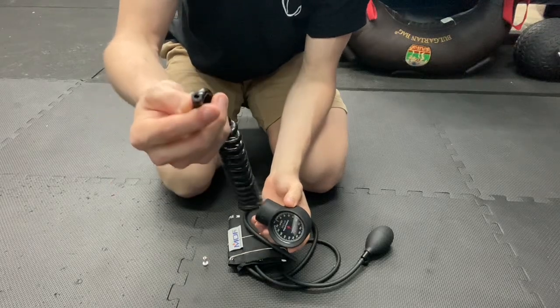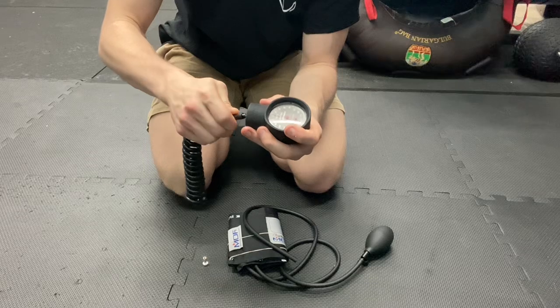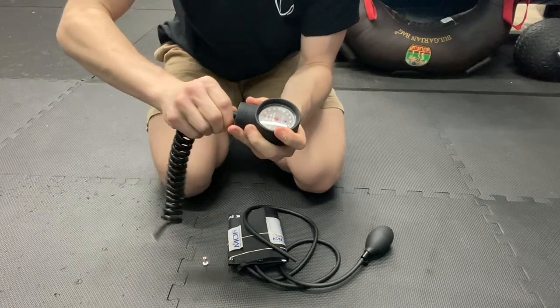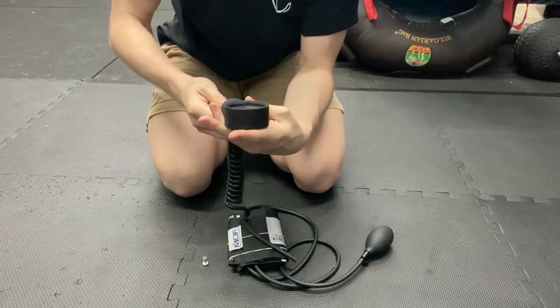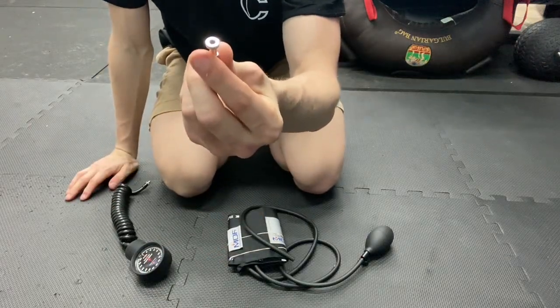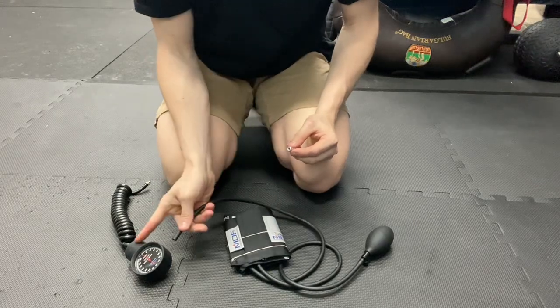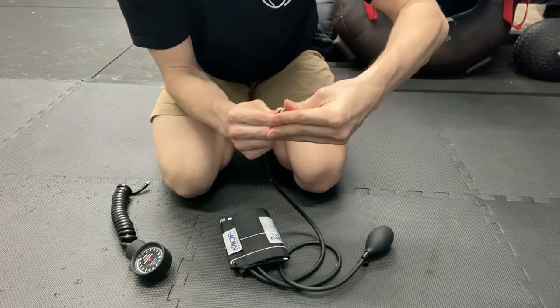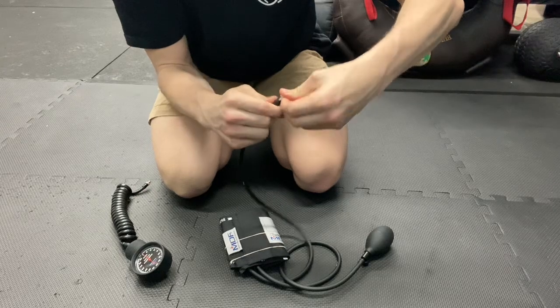So now you're going to take your hose, the empty hose part, and you're simply going to replace your initial hose with this hose. And then from here, we're going to take our female Luer connector and we're going to stick that in the end of the hose that was just in our gauge. It's not too hard. Might need a little bit of elbow grease to put it in.